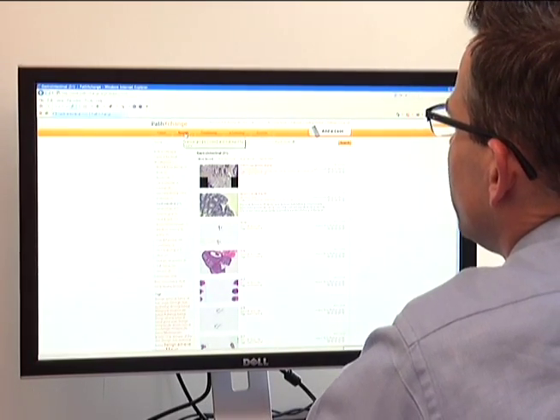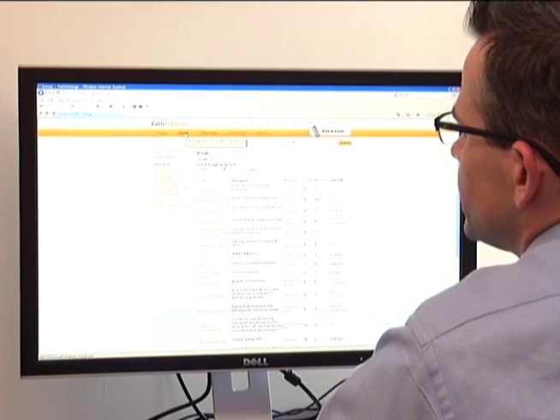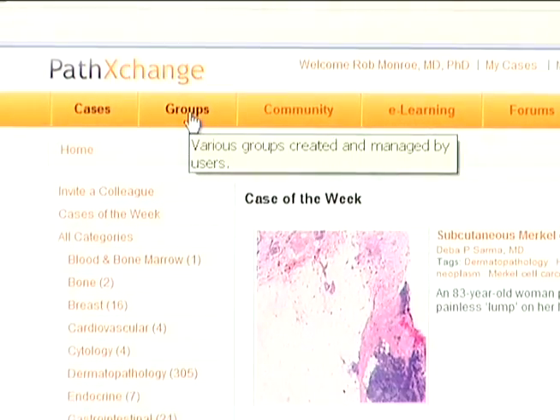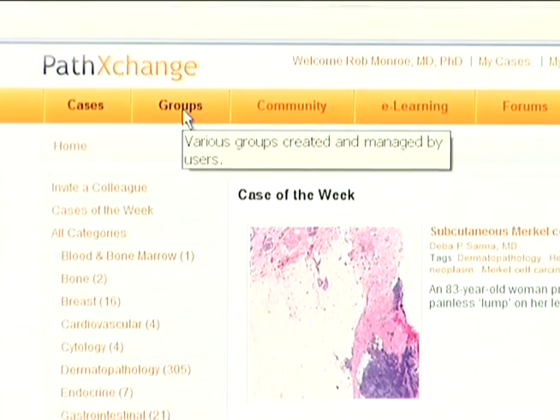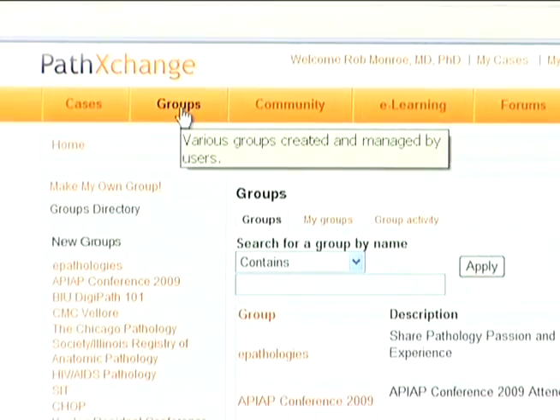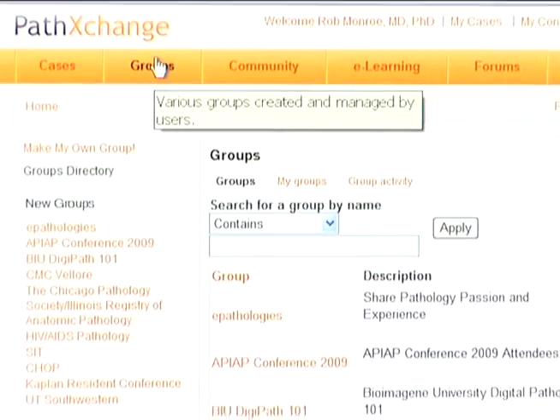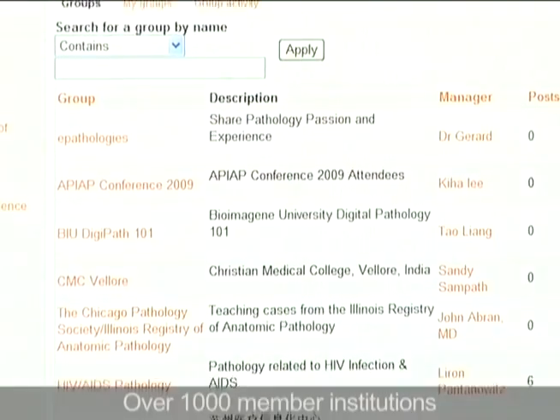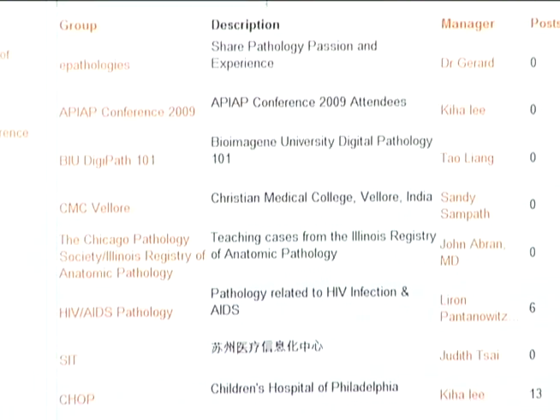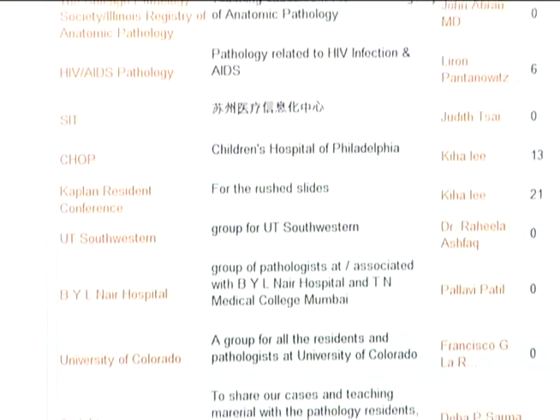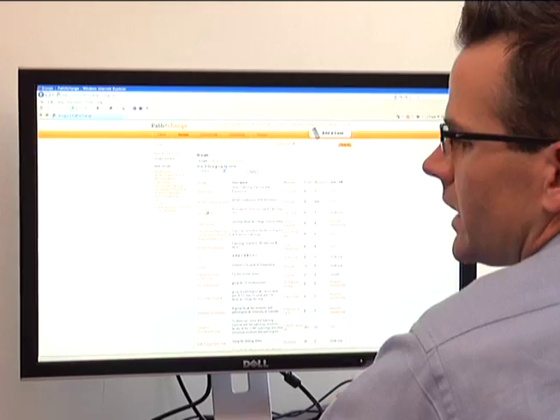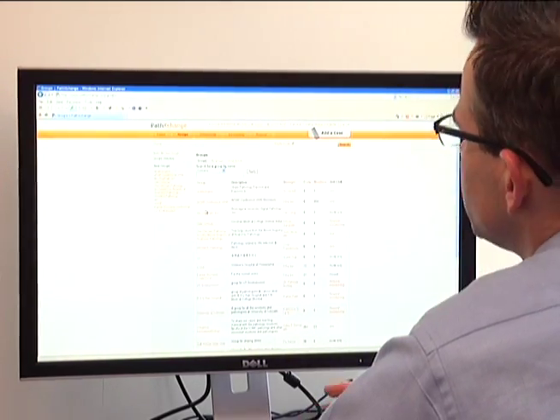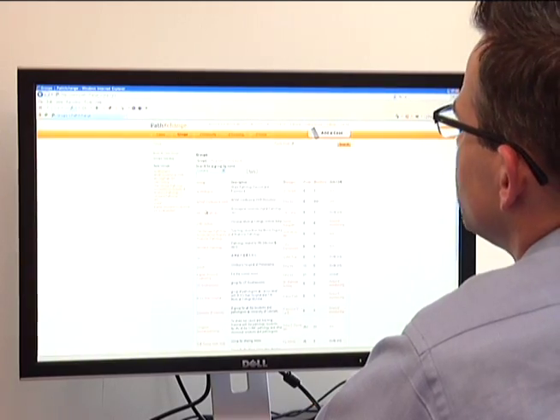One of the other interesting functionalities of PathExchange is the ability to form groups. You can restrict the types of pathologists, or the pathologists that gain access to the content that you provide, by forming groups and then making available only to members of your group those cases that you're posting. These groups can then post content viewable only to their members for teaching purposes, for sharing purposes, and so forth.